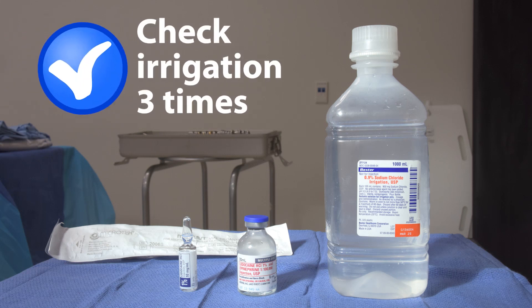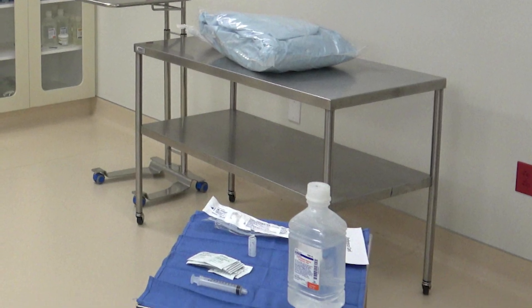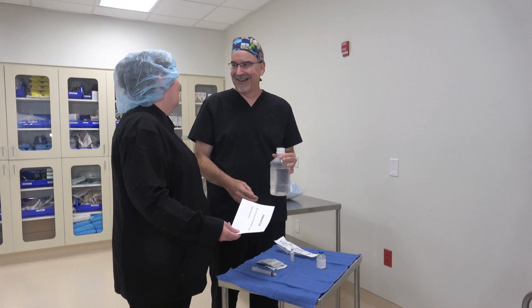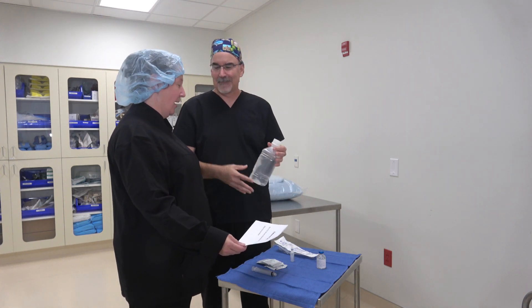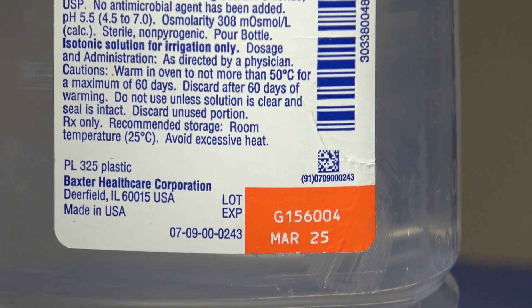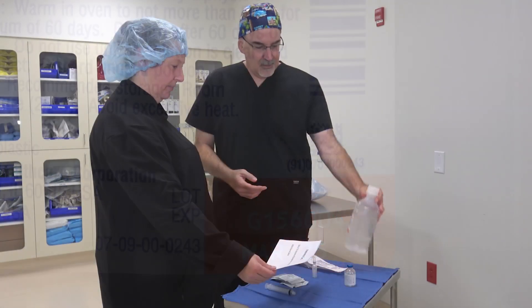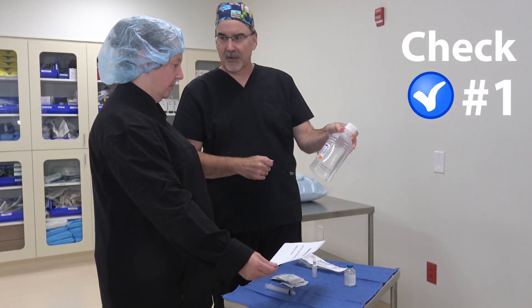To confirm that we have the correct irrigation, we must verify it with the circulator at three different times throughout the process. The first check happens before we open our back table pack. You and the circulator together verify that the gathered irrigation matches what is on the surgeon's preference card and that none of the medications or irrigations have expired. I've got 0.9% sodium chloride irrigation, March 2025 expiration.